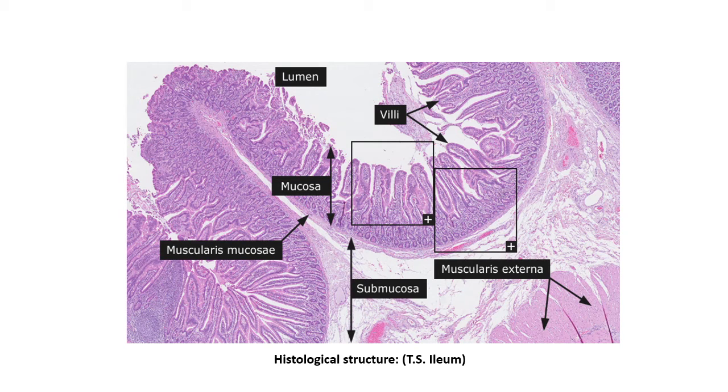But in between, a muscularis layer, these longitudinal and circular muscles are moreover concentrated, and the outermost layer is serosa, or it is also called adventitia. So adventitia, muscularis, submucosa and mucosa. So these are the four important layers showing in the diagram clearly.